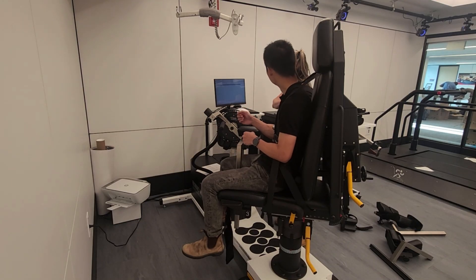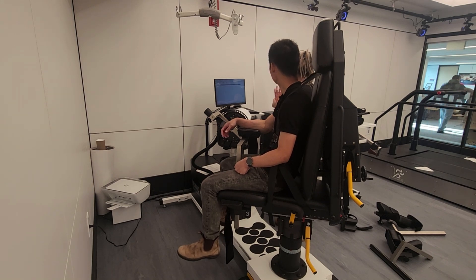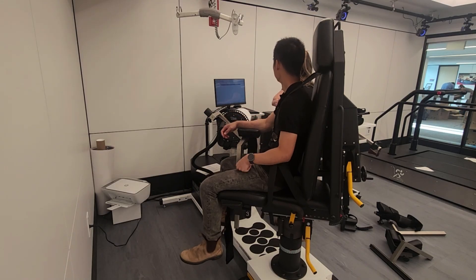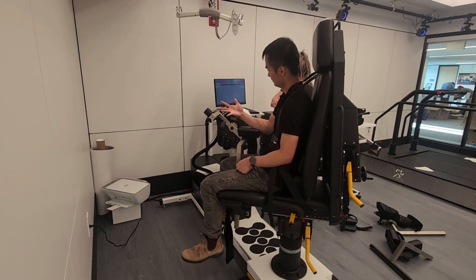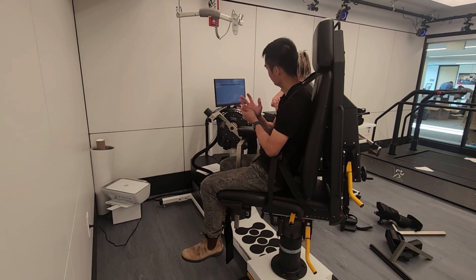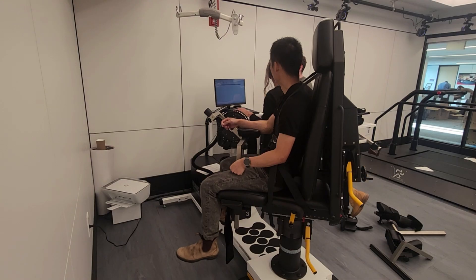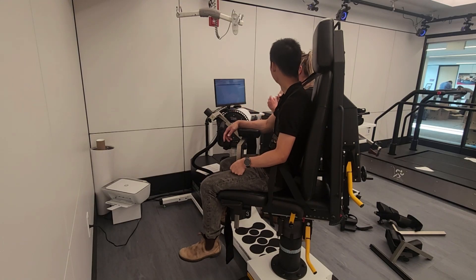We'll make sure that we have dummy-proof instructions so that we know exactly what numbers to put in, and then we'll highlight which ones you adjust slightly to the person. I will make sure that this glitch is gone so that this does not happen, because it really is embarrassing. I had to do it on two clients — when you have someone lying down on their foot and then you've got to take them all out, you're like, oh sorry. How much did you get? I haven't looked — you probably beat me.